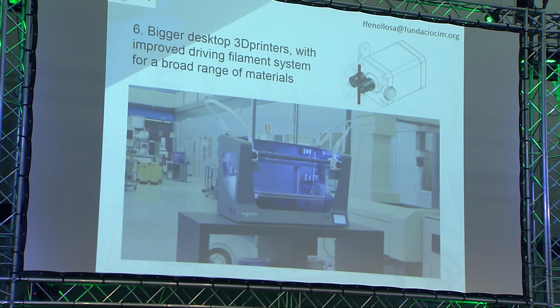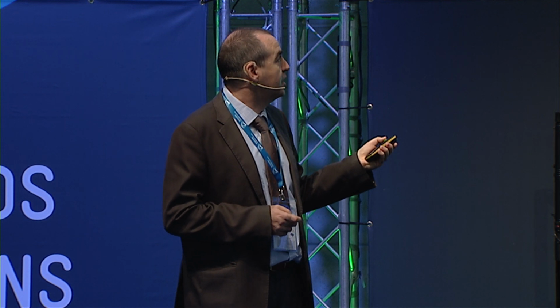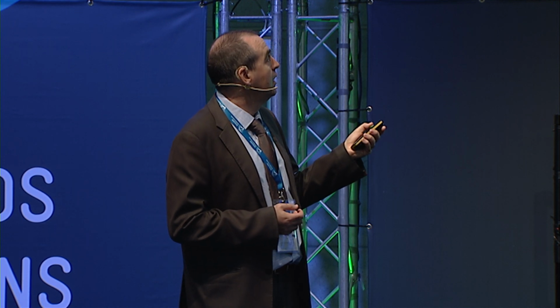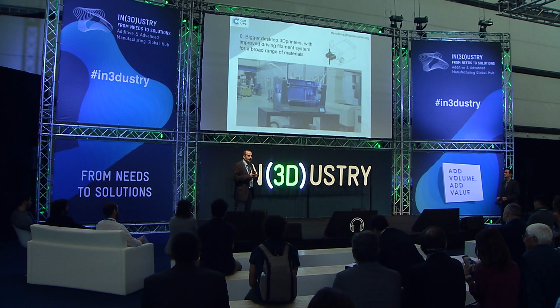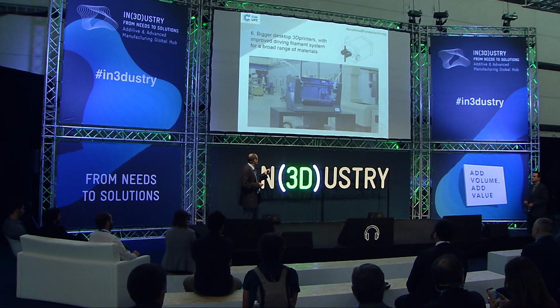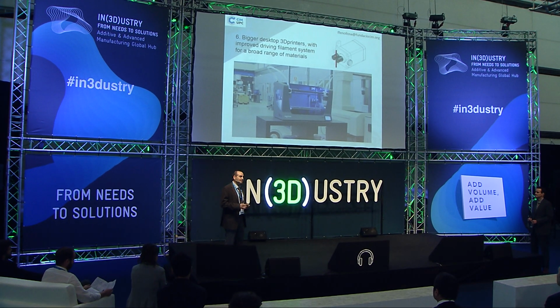And we are working here, for example, you can see the new CIM-UPC printer. It's a printer with a large surface capacity. It's not only that here we can do a very huge prototype with an open source machine. It's the fact that here we have improved, for example, how to treat the filament. And this is going to allow us to process soft material, soft filament, soluble filament better, with the aim of surgery prototypes that are multi-material, with very impossible geometry, improving their quality. This machine was just shown at Birmingham just this past week.